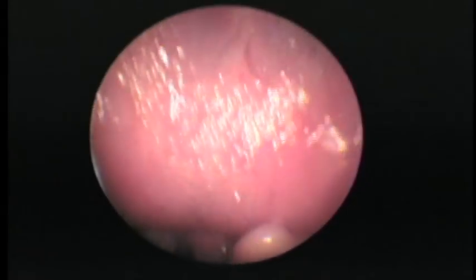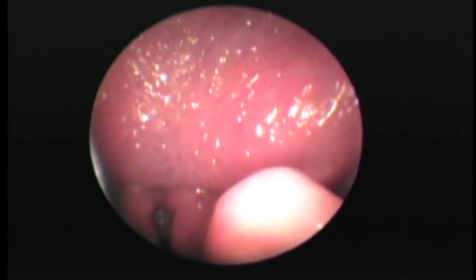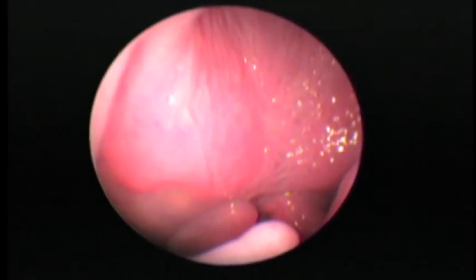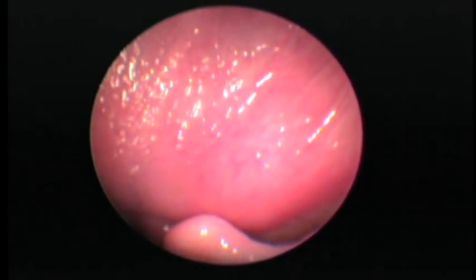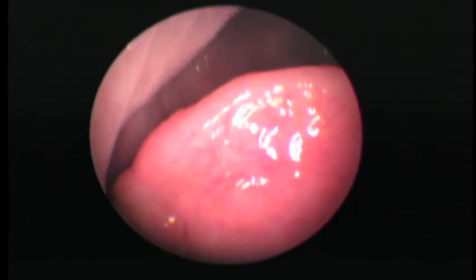But this, you can see, is extremely spongiform tissue. This is the supraglottal area, and this used to be the area that we thought this edema was a factor. But we've seen this edema in dogs that absolutely have no issues with their saccules at all.